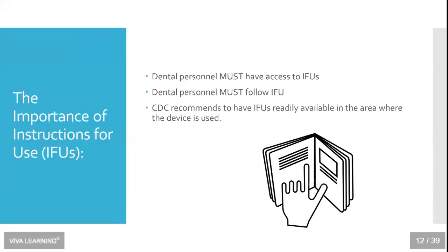Going back to my slide, I stress the importance of the instructions for use. I mentioned earlier that dental personnel must follow the instructions for use, and CDC recommends having these instructions readily available where the device is being used.